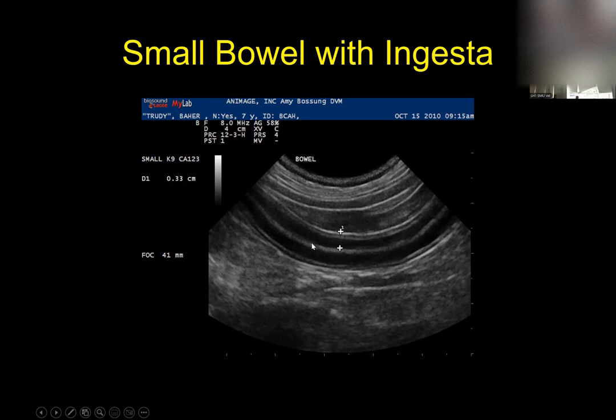And then just in the middle of the bowel, you have this other white line. So we have distinct layering, and we have 5 layers. There's 1 out here. There's 2 right there, the thin black line. There's 3 right here, the thin white line. Then you have the inner thick black line, that's 4. And then the 5th one is right in here.